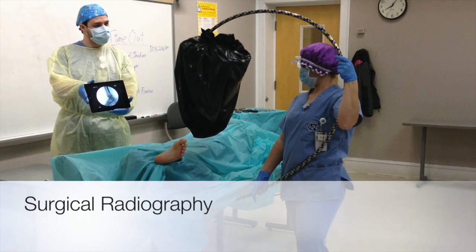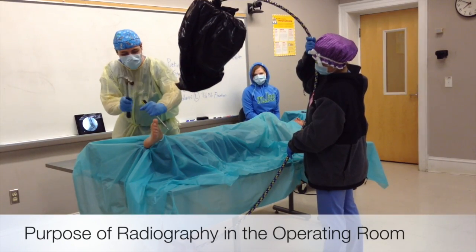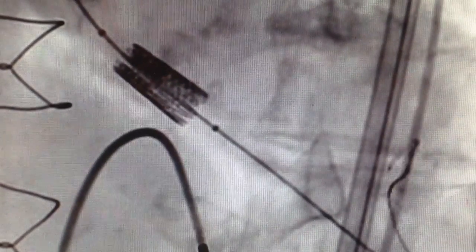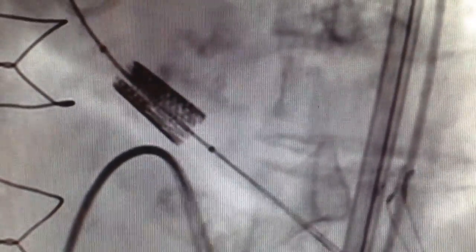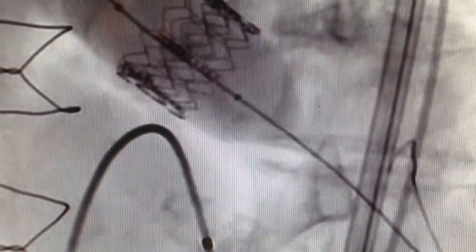Surgical Radiography. Purpose of radiography in the OR. The main purpose of radiography in the operating room is for the surgeon to view internal structures of the body so that he or she can perform the operation correctly, such as proper placement of any hardware or lines or removal of any anatomic structures or abnormalities.